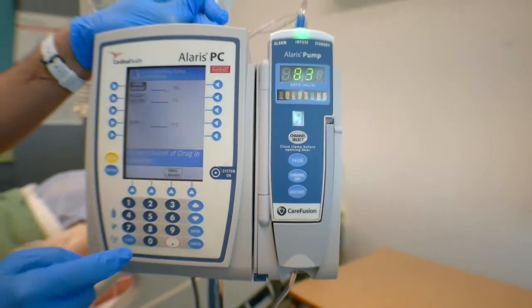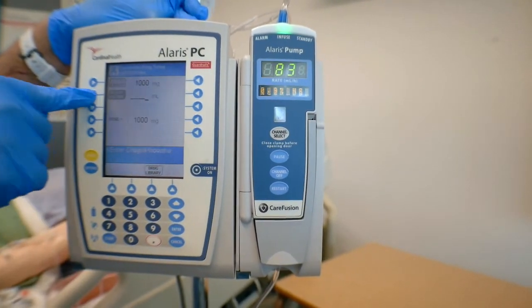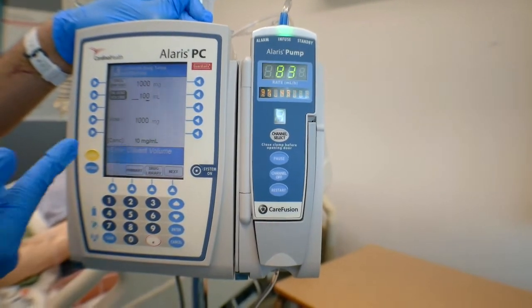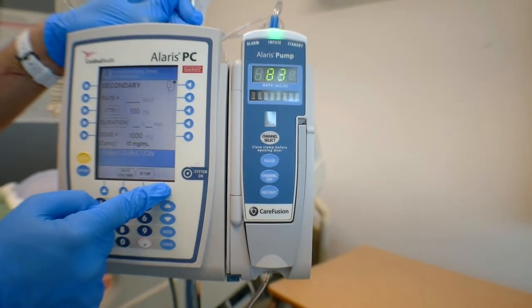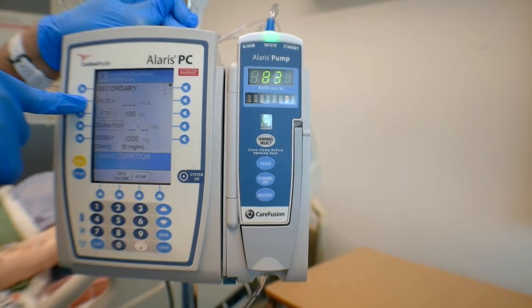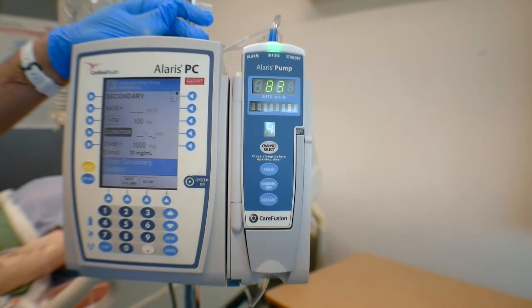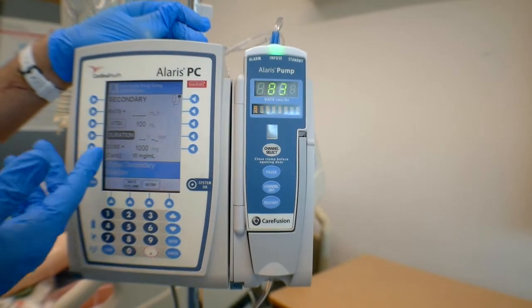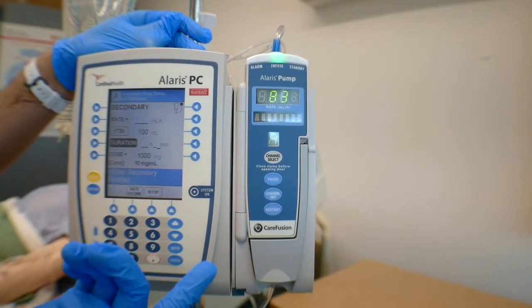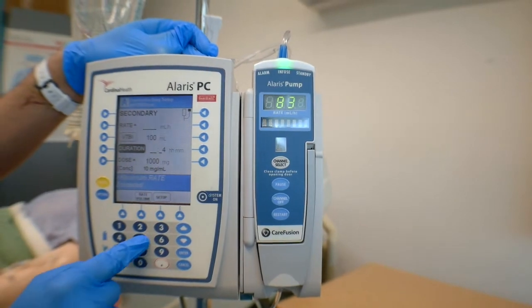So drug amount would be 1,000 milligrams over 100. So we're going to press next and hit duration. For these machines, they usually ask for the duration more than the rate. So for this one, we are ordered to infuse it over 45 minutes. So I'm just gonna put 45.